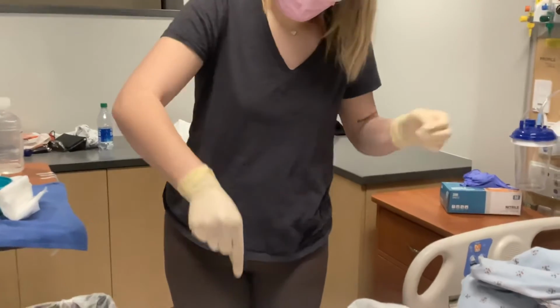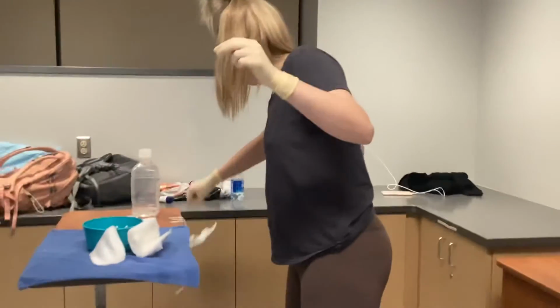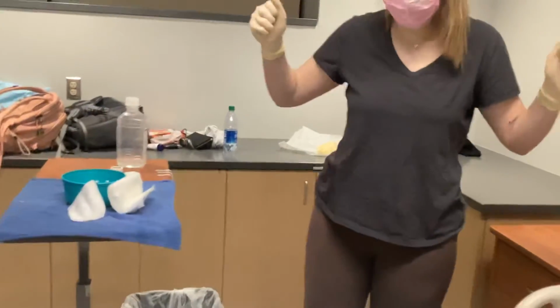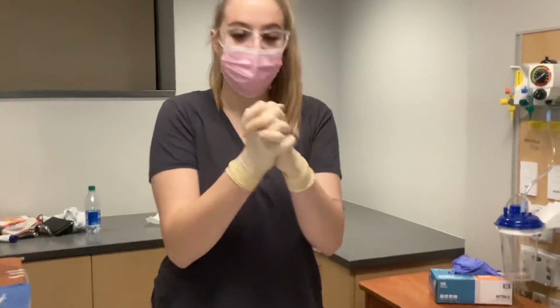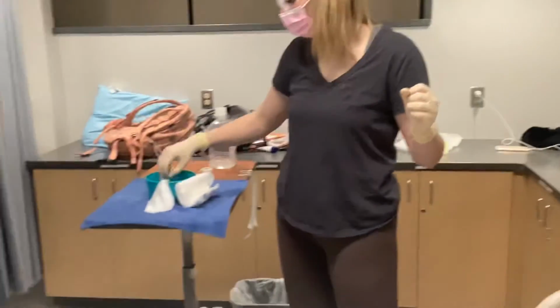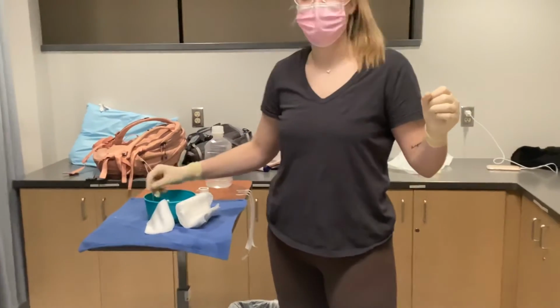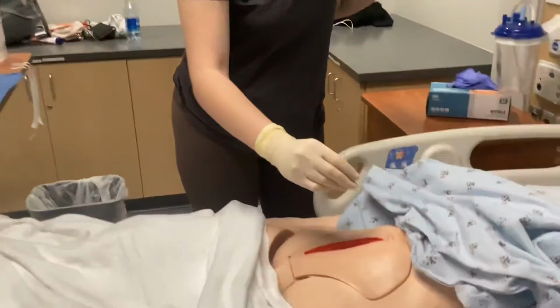All right, now I'm able to remove in the center because it's sterile. Out of the way. And now I will interlock my hands. All right, Mr. Jones, I'm going to start cleaning that wound. And now I'm going to clean from the cleanest to the dirtiest, so that means I'm going to go from the inside to the outside.